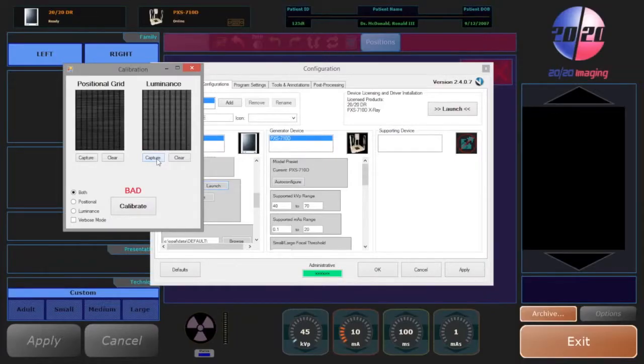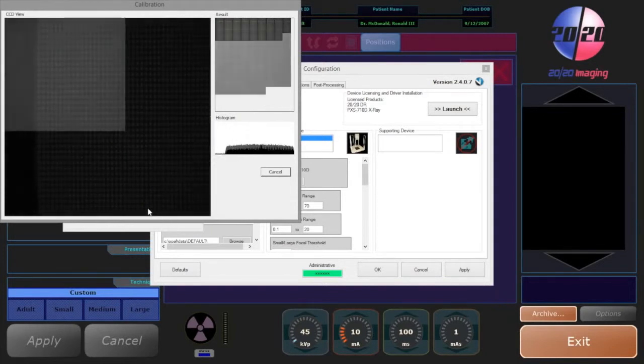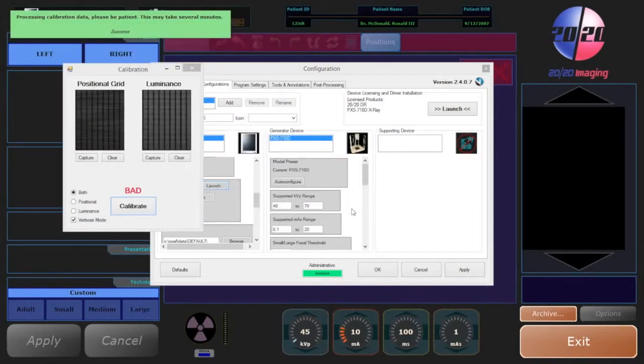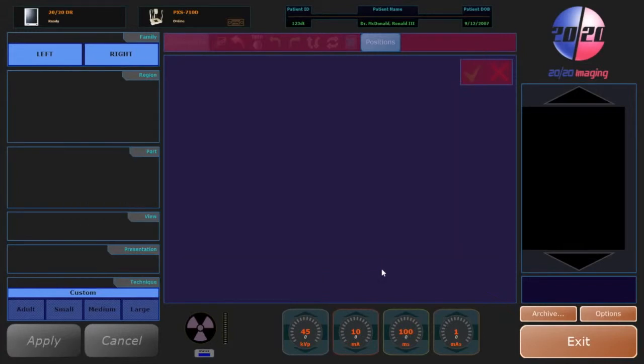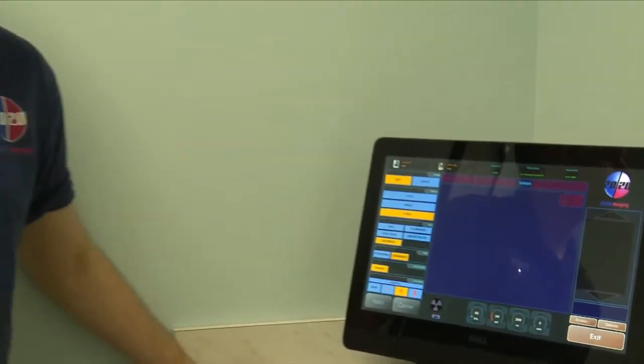Once you have both of your shots taken, go ahead and select calibrate near the bottom to finish the calibration. If you're interested in seeing any details during the calibration, you can select verbose mode at the bottom. Otherwise, click on calibrate. We are now finished with calibration and the system is ready for use.